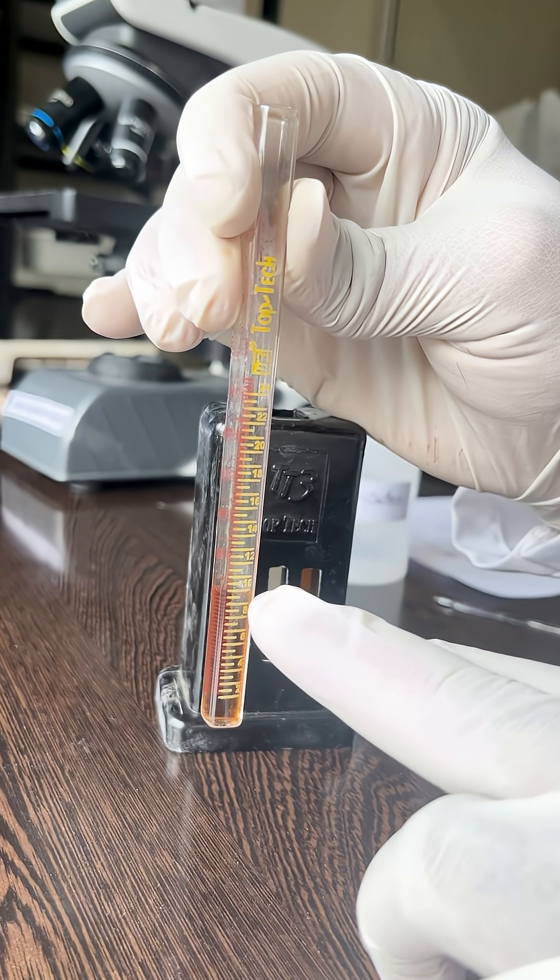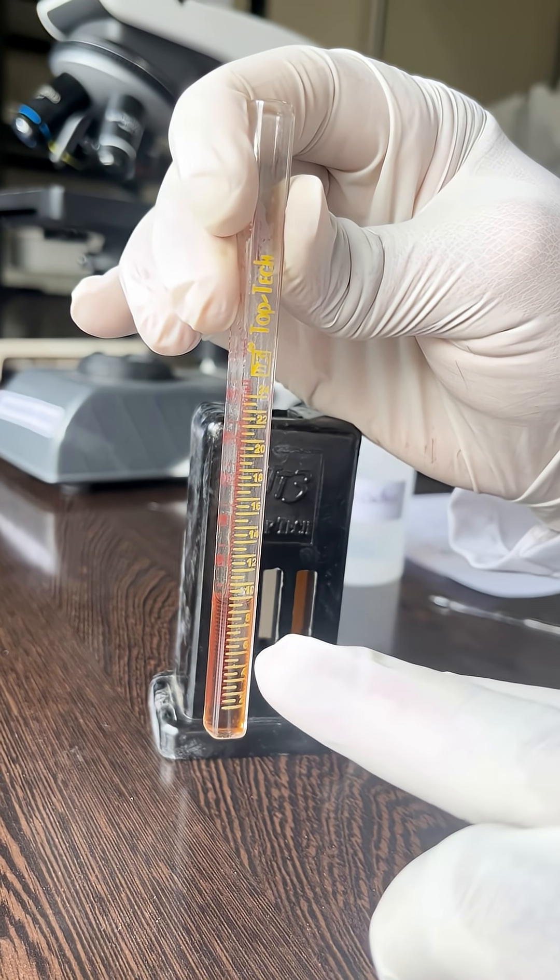The Hb value is 9 grams per deciliter in this sample. Thank you.